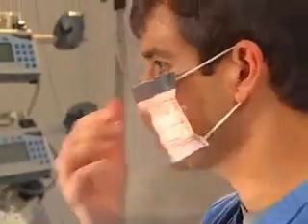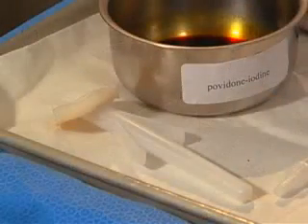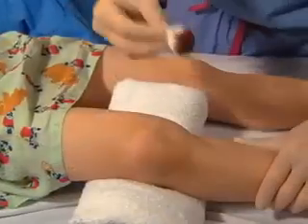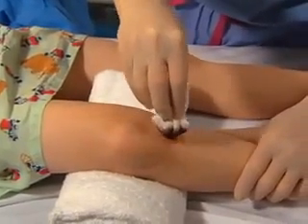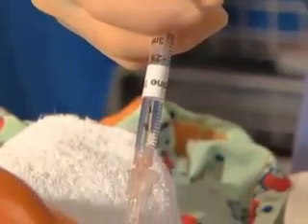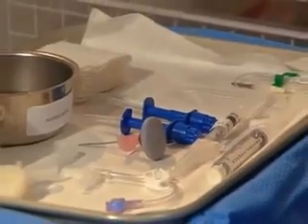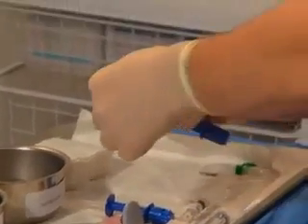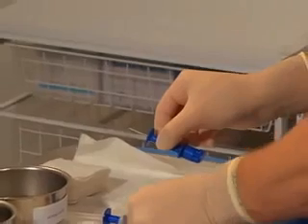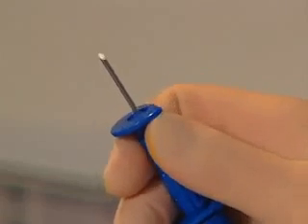Wear protective eyewear and sterile gloves. Using aseptic technique, clean the chosen insertion site with either chlorhexidine or povidone iodine solution. In awake and alert patients, infiltrate the area with lidocaine to provide local anesthesia. When using manual insertion, remove the safety cap from the needle. Ensure that the stylet is appropriately placed within the needle and that the bevels are aligned.